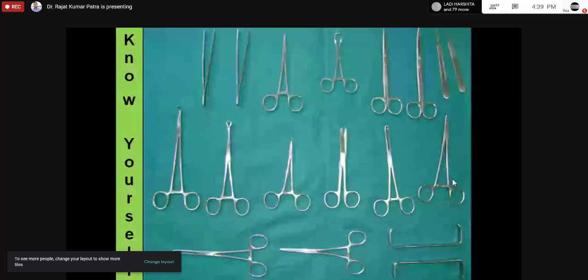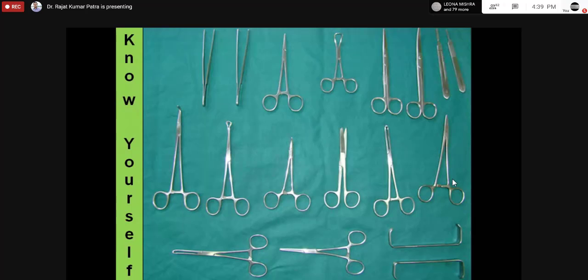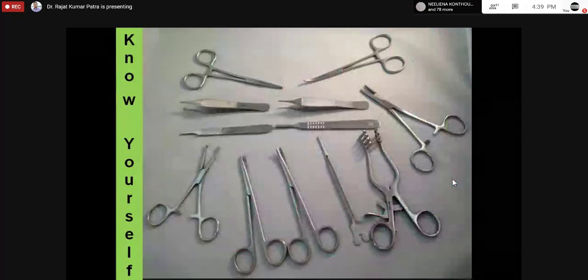And scissors you can identify. The only confusion will be with this one, that is mosquito artery forceps, or Spencer artery forceps, medium sized or large size artery forceps. Mosquito means small forceps. These are used mostly in pediatric surgery. It may be curved, it may be straight. Okay, tell me first.